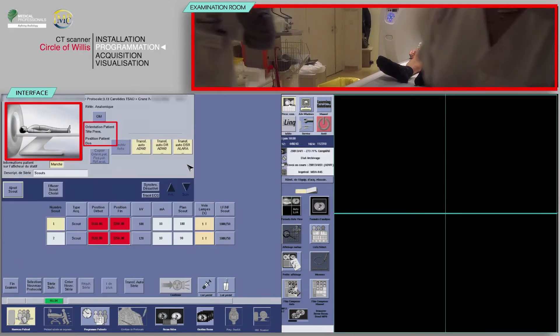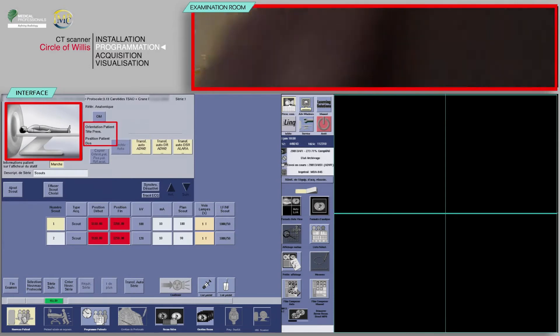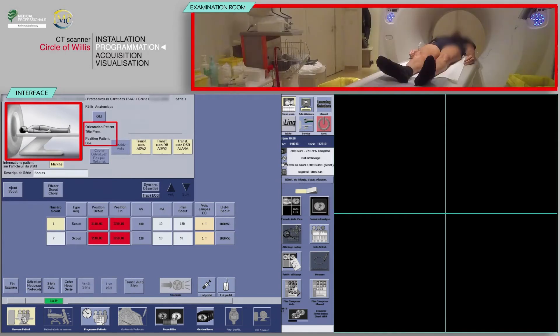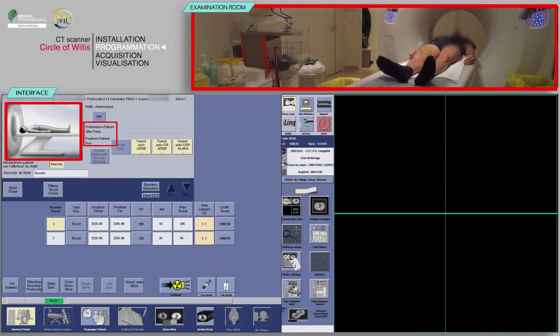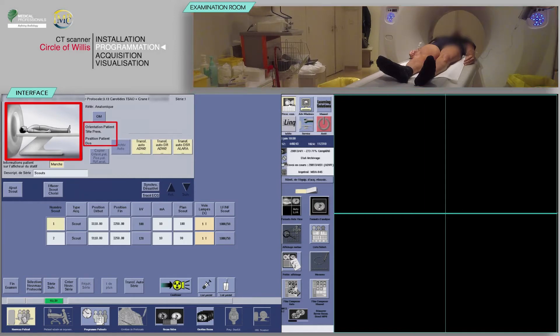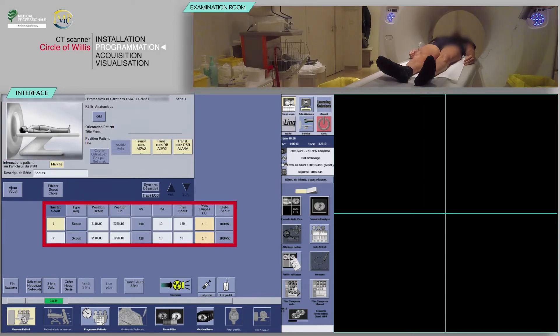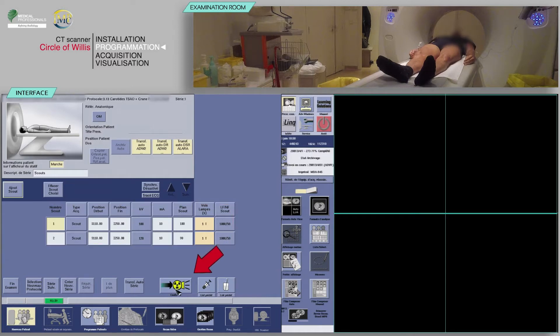Check that the patient's position on the table matches the one indicated. Note that the patient's orientation is head first. After checking the scan parameters, click on confirm.